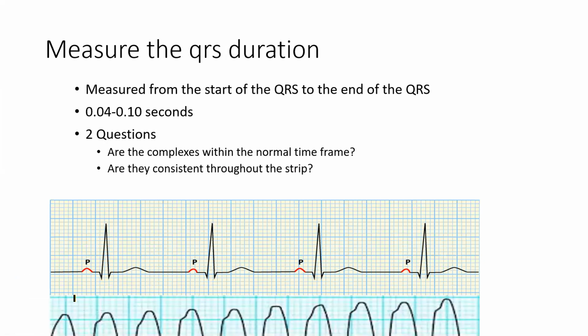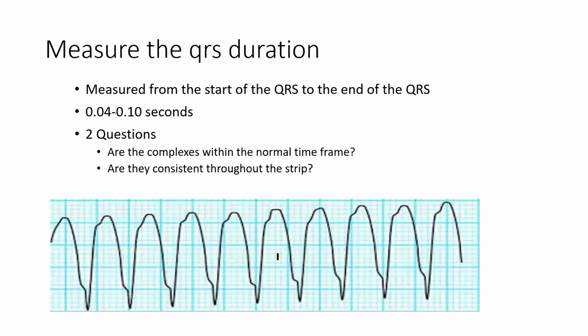Moving on to the next one. This is a very bad situation in case you're wondering, but this is not a good day for people, okay? This is typically ventricular tachycardia. These are all QRSs. They are wide. They are all over the place. You cannot see a P wave at all. You cannot see a T wave at all. All you see is this very large and wide R wave just kind of hanging out doing its own thing. And this is not a good day for this patient.